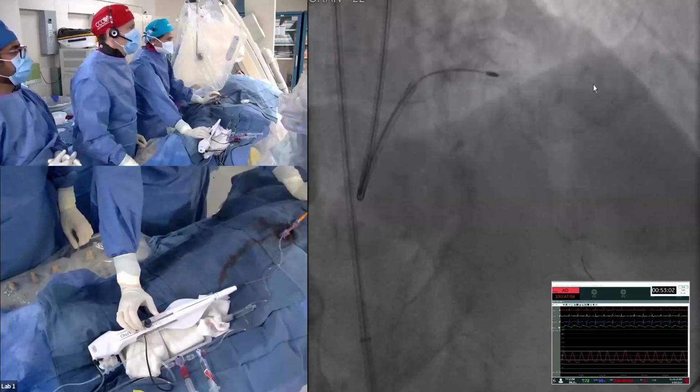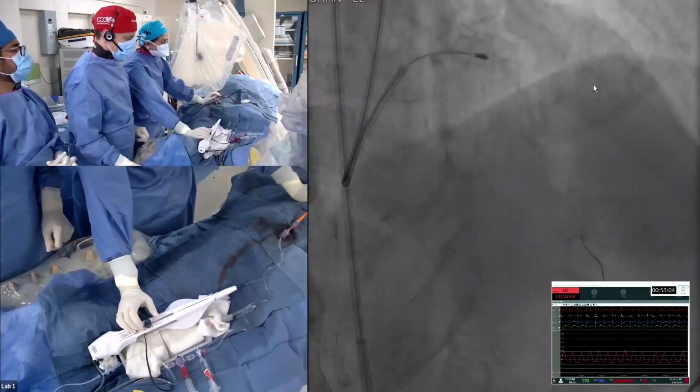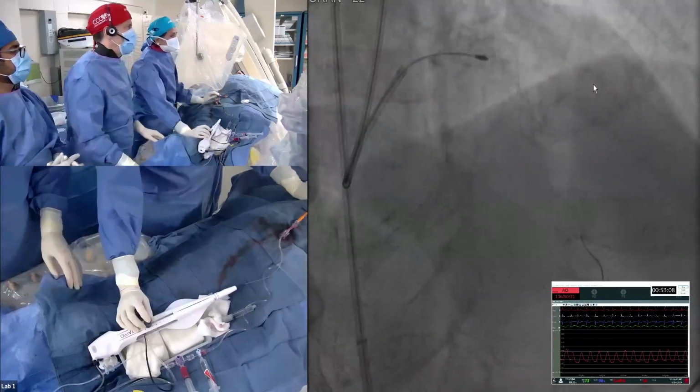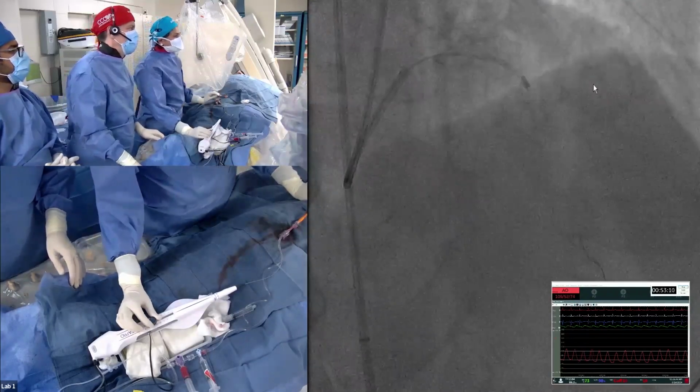It's a sneak and attack technique. You can see how it sticks. Sorry, I didn't mean to interrupt. What were you saying? No, it's called sneak and attack. Oh, yeah, sneak and attack. Okay, there we go. Attack for the calcium.